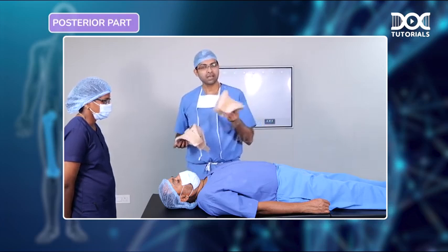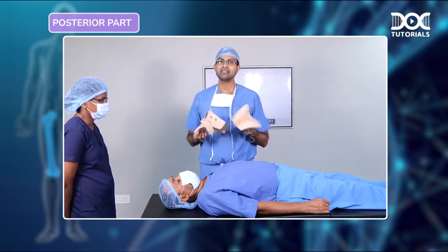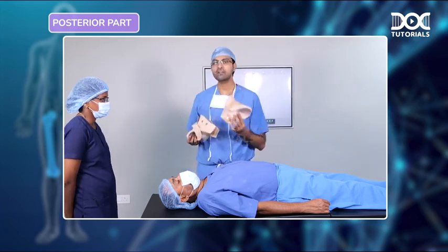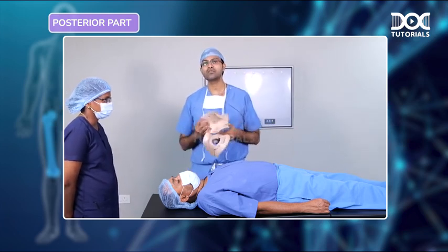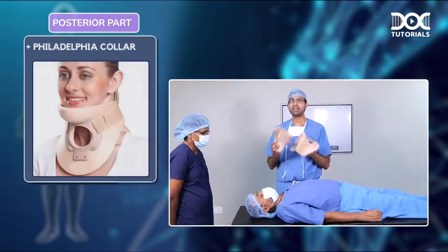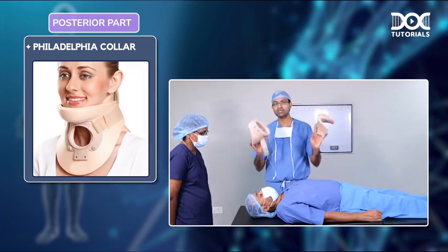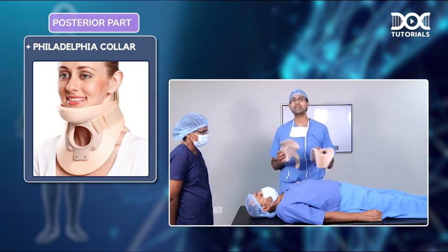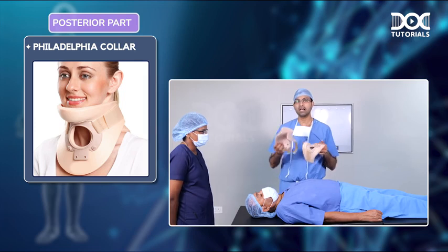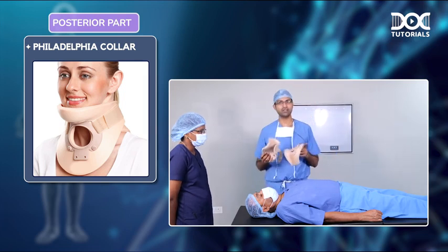Now the question is, why do you want these two parts? See, if you only use a single collar with a single piece, the problem is that you may have to manipulate the neck too much to apply this. But in the case of Philadelphia collar, because it comes in two separate parts, you don't have to manipulate the neck too much. You can easily slide the collar in and put it. I'll demonstrate to you how to put it now.